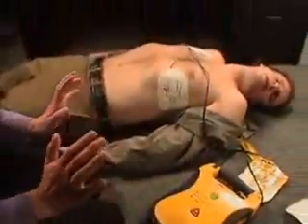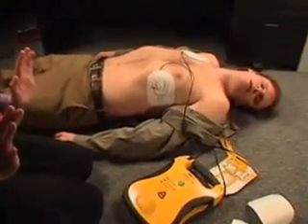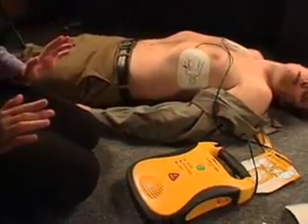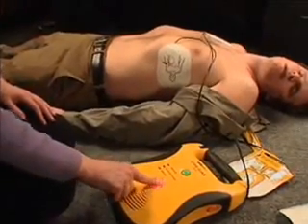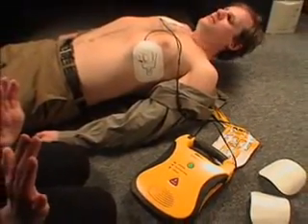Analyzing heart rhythm. Do not touch the patient. Shock advised. Charging. Stand clear. Press flashing shock button. Shock 1 delivered. It is safe to touch the patient. Begin CPR now.